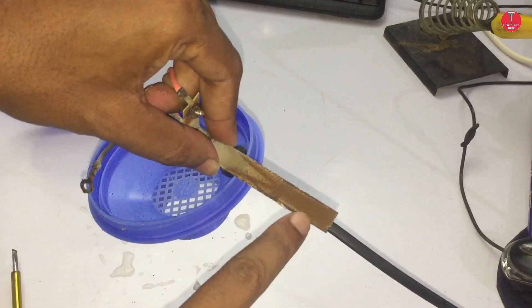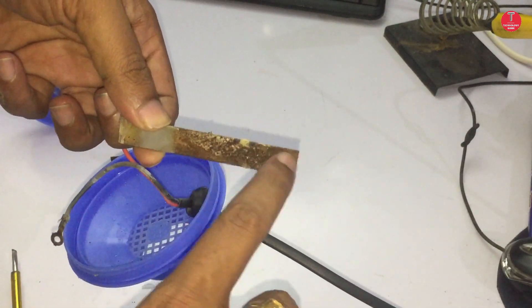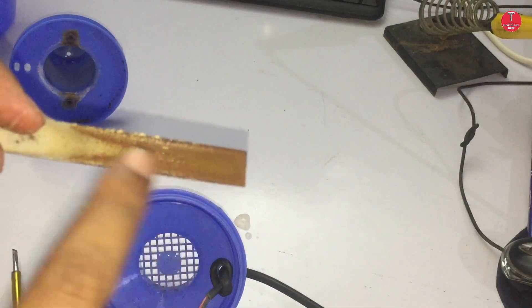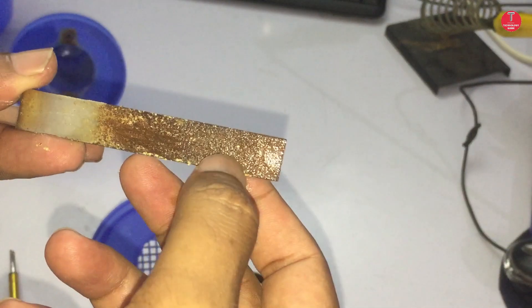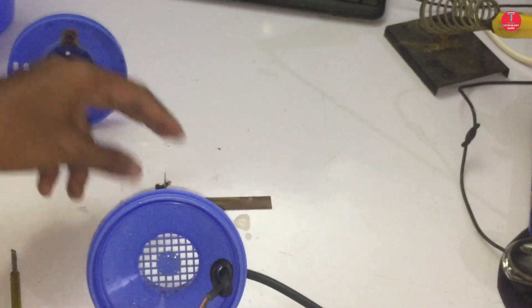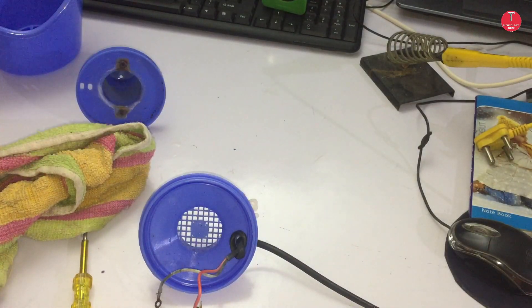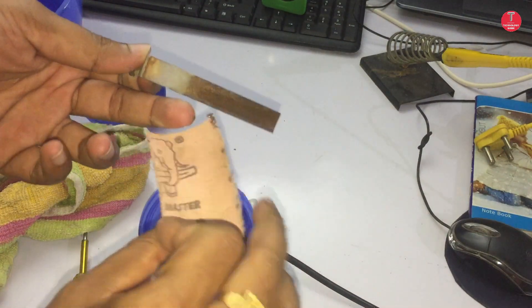Now we can find rust deposits on the surfaces of the electrodes. Clean the electrodes with sandpaper properly.